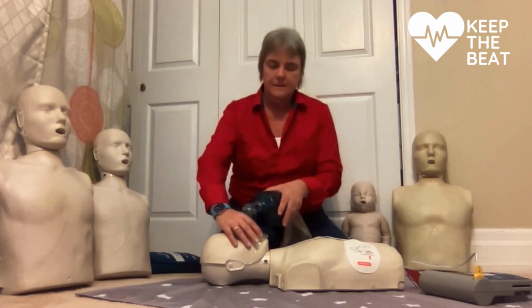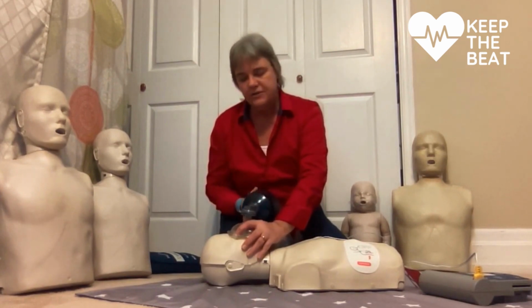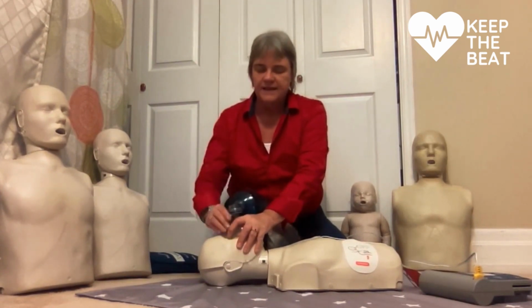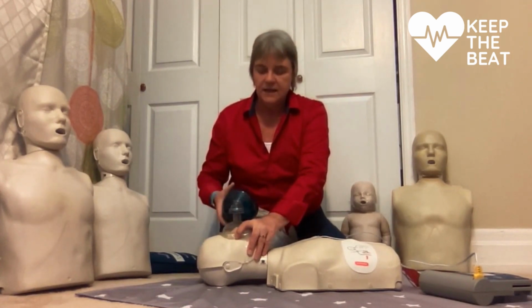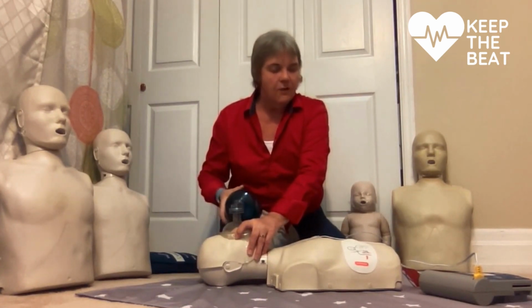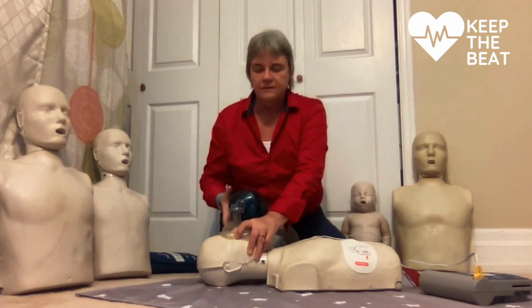I place the mask over the patient's nose and mouth. I bring the head back, and with the EC technique, I ventilate. I want to ventilate just enough to barely see that chest rise. I don't want to overfill their lungs.